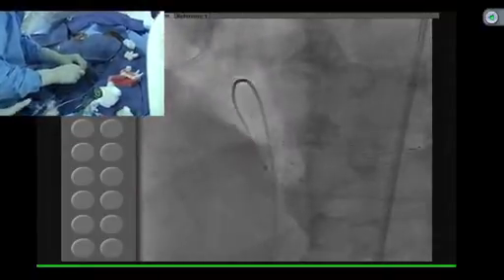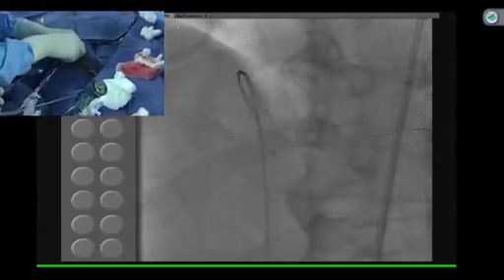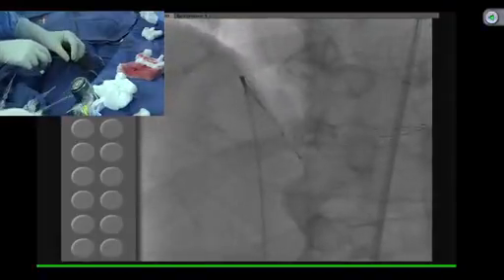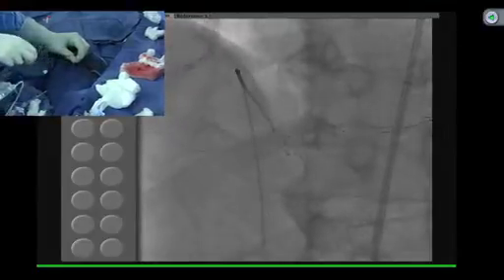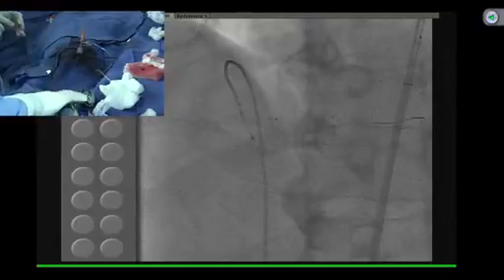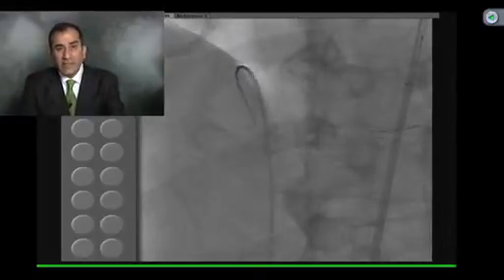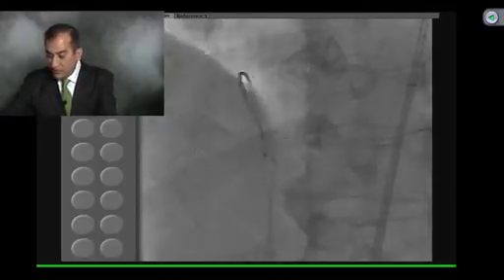So let's take the PDA balloon out. PDA balloon is good. We can take that out. This is the one. So, I mean, you also mentioned during ad hoc PCI of staged lesions, some people would argue that it may be a better strategy when you have complex cases to first do the more complex lesion, because just in case that fails, you still have an option for surgery, whereas you could do a simple lesion, do a procedure, then fail later with the complex one, and that may not be the best solution.